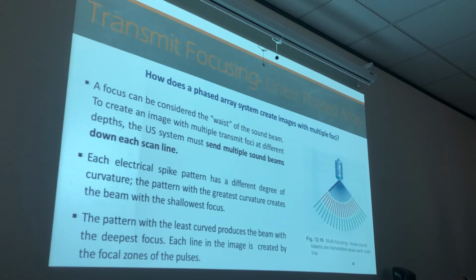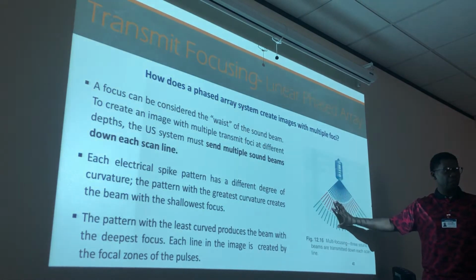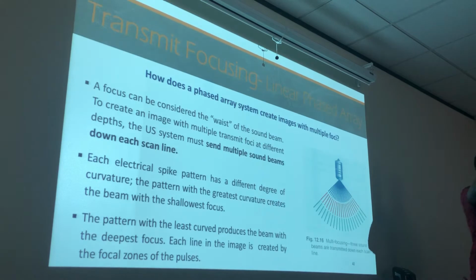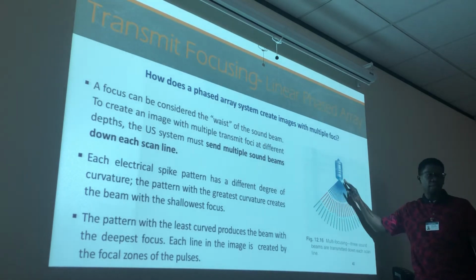That first line will come back. Then it'll send out another scan line down that same scan line, and go back. Then it'll send out another at the deepest depth, and go back. The only thing is, it's only going to take information from the appropriate areas. So that scan line is not going to take any information from deeper depths. It's only going to take information from the shallow, intermediate, or distal depth, depending on how many focal zones you have up, right?